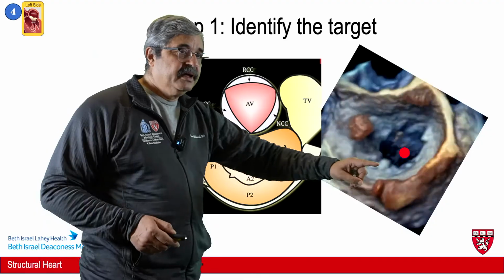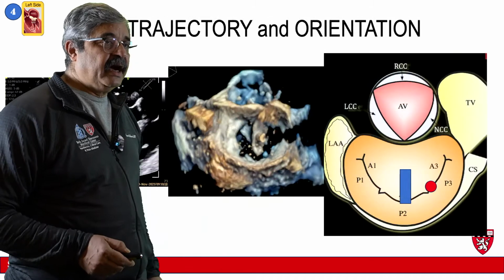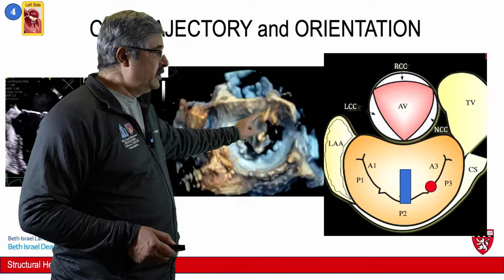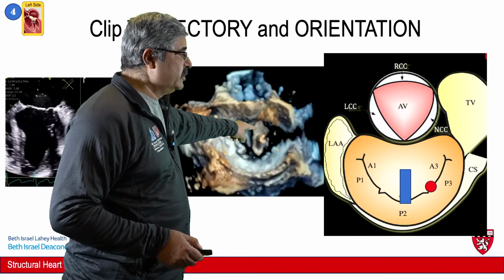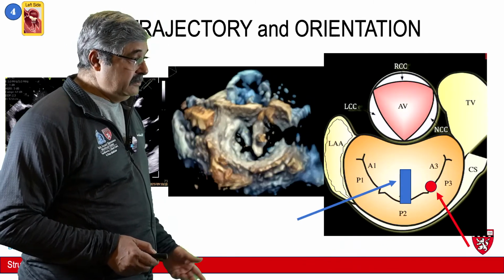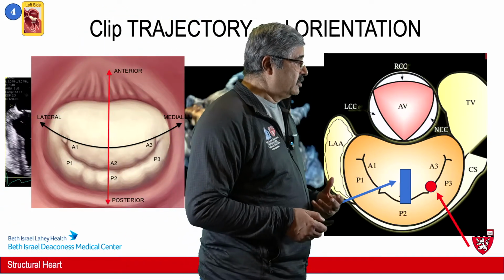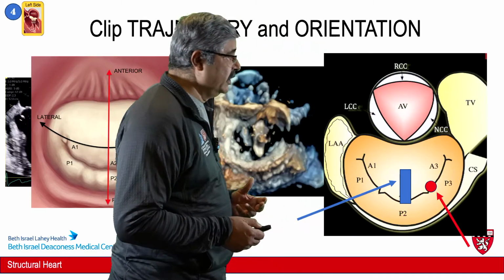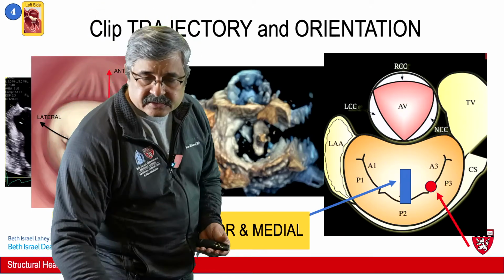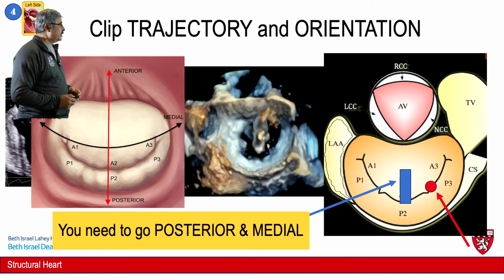Looking at this mitral valve, we identify the target between A2P2 and A3P3, and then we guide them to this location. Now, in this specific situation, you can see that the clip is very anterior. It is above the line of coaptation into the anterior valve. Take a look at it. This is the target. This is where the clip is. And if you look at it on the valve, this is the center portion. So if you want to tell them where to go in relation to the target, the correct guidance would be, if I make myself smaller to show you, that you need to tell them to go posterior and medial to the point of target to get over there.